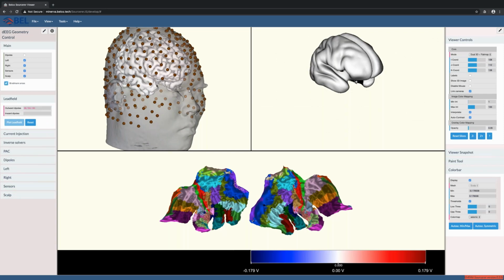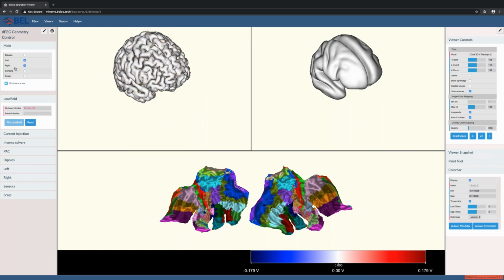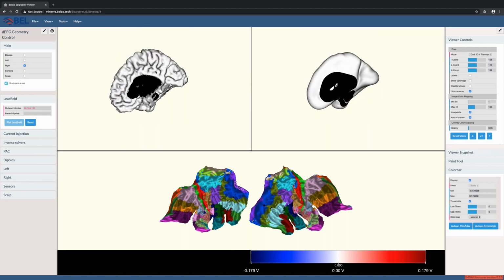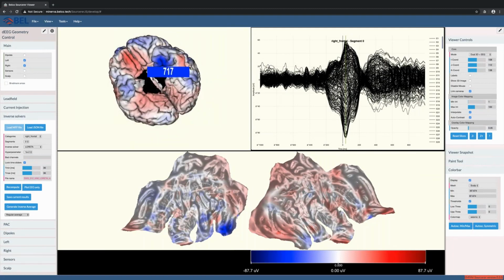Each individual electrical dipole is mapped and can be utilized in different ways. We can plot the lead field of a dipole and show the forward projection of scalp activity. We can see current density. We can see the interior brain with individual dipoles. We can also see an individual dipole plotted on the Brodmann map view. This truly shows how electricity works in 3D.